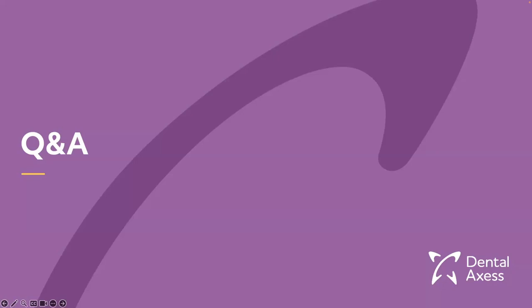Remember the forces that we showed in the presentation? It's the same. If we have a rotation of 10 degrees, remember, it's only 1-2 degrees per aligner. That is the only amount we can achieve per aligner. If we have 10 degrees but we want 3 aligners, those 10 degrees of rotation cannot be achieved. So we need to keep that in mind when we are requesting a reduced treatment plan. That can be done, but the end result, or the final position of the teeth, is going to change. It's not going to be ideal.